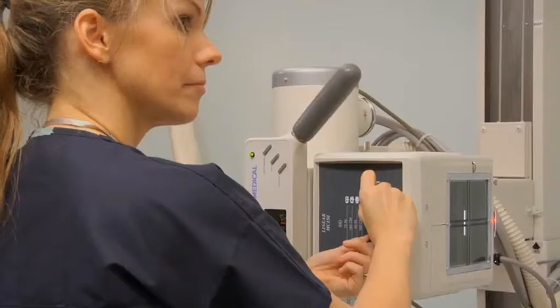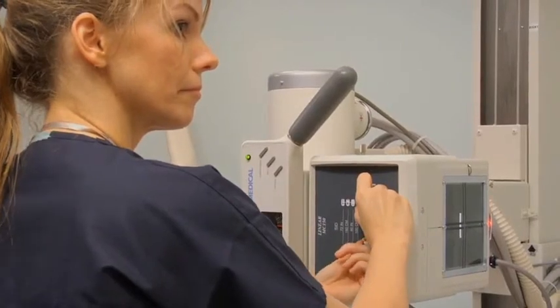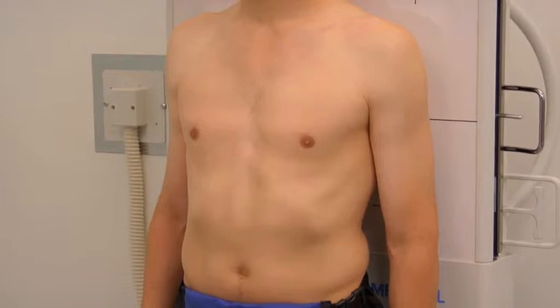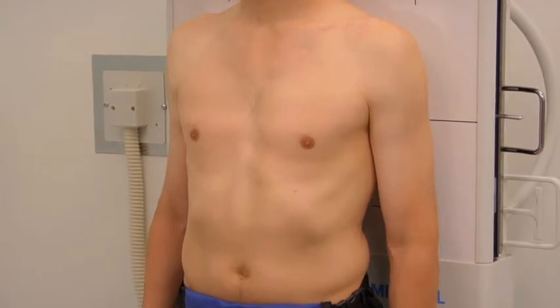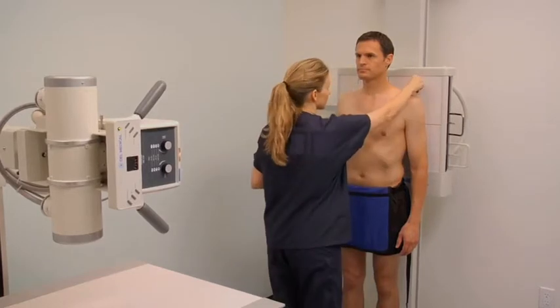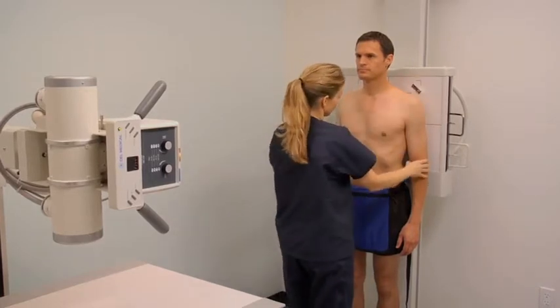Collimate to 1.5 inches above the shoulders and include the lateral soft tissue borders of the chest and the diaphragm if possible. Position the left lead marker on the upper left corner of the image receptor.